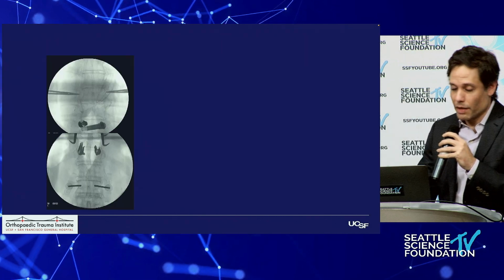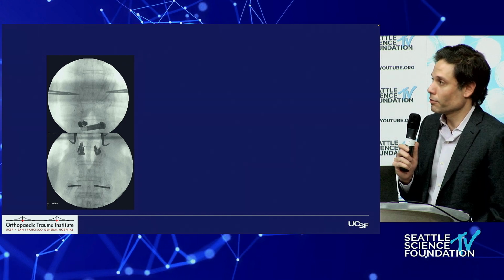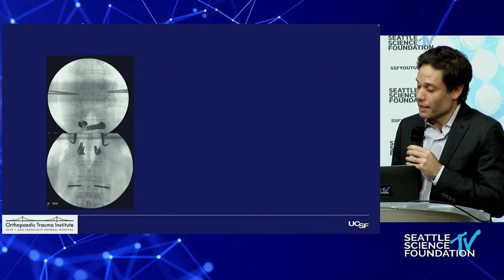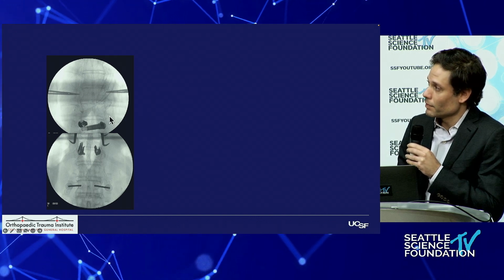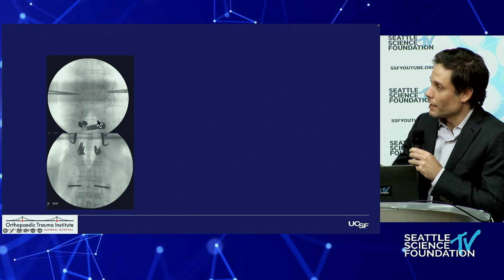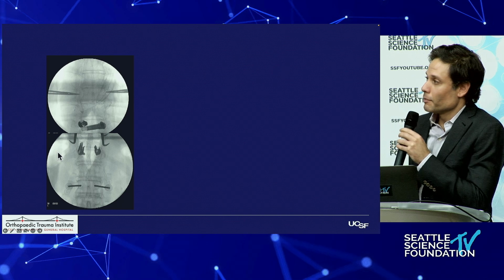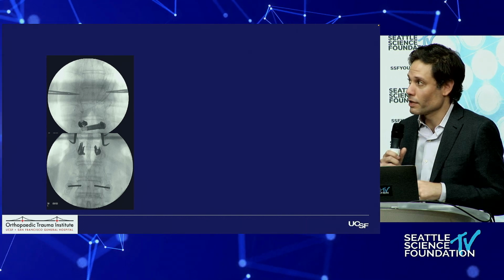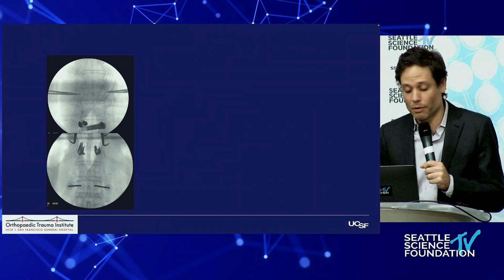This is sort of the approach. For the ankylosing spondylitis patients, I'll usually go 3 above, 3 below. These are fluoro images, and you can see from the soft tissue shadow that we only opened from here down below. We did a mini open approach for the middle 2 screws, and then percutaneous at the ends of the construct, so the 3rd level above and the 3rd level below.